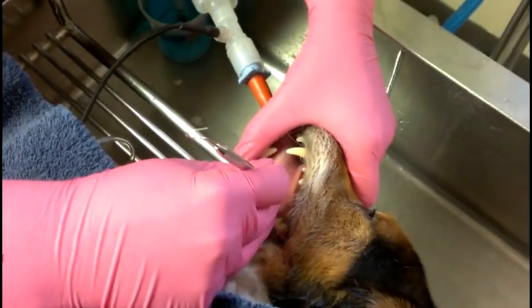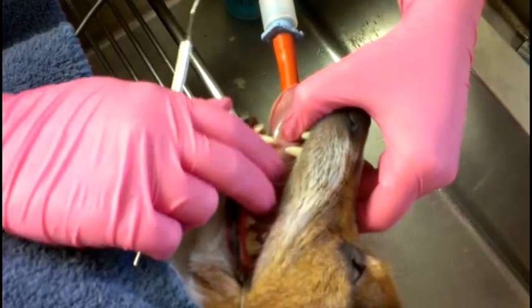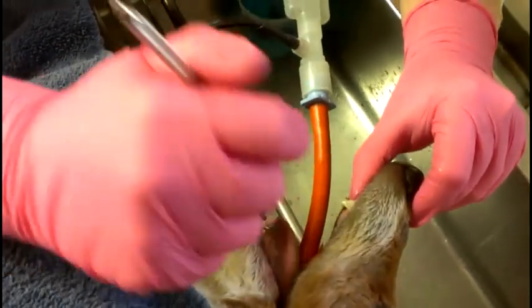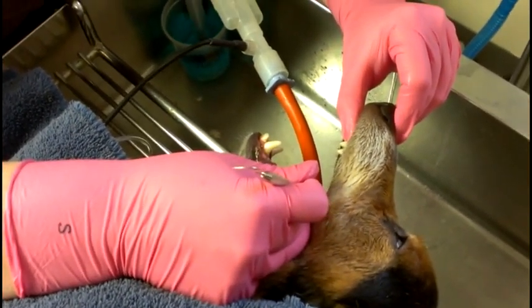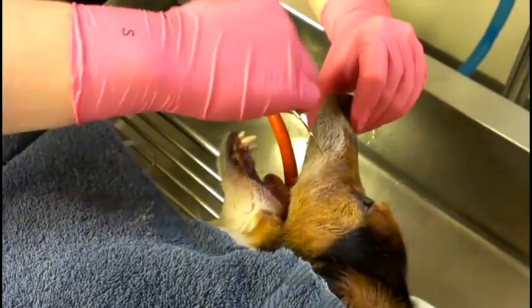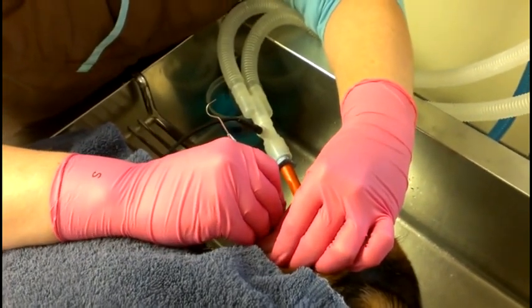So I'm just going to kind of go through, check everything, make sure everything looks good. I like to look back in the back of their throat, make sure I don't see any problems with their tonsils, their pharynx and that kind of thing as well. So check the inside of all the teeth, and then once I finish this side, we'll go ahead and check out the other side as well. We'll flip her over and I'll check the other side and make sure I don't see any issues or any problems that need to be addressed.